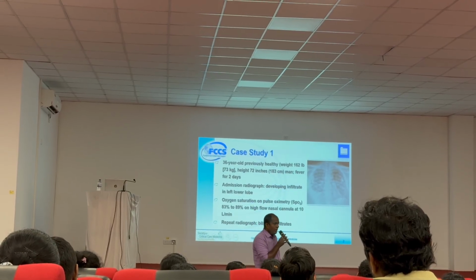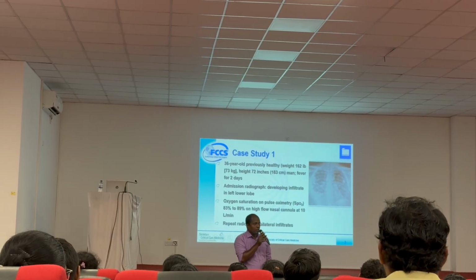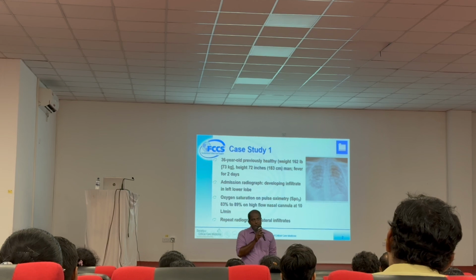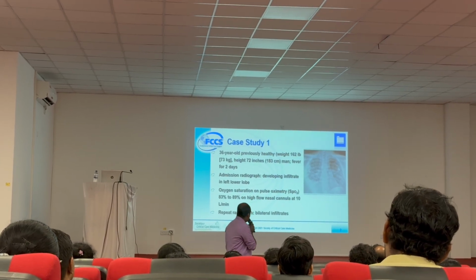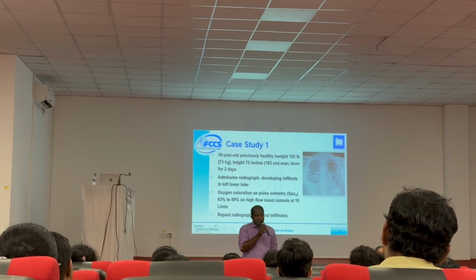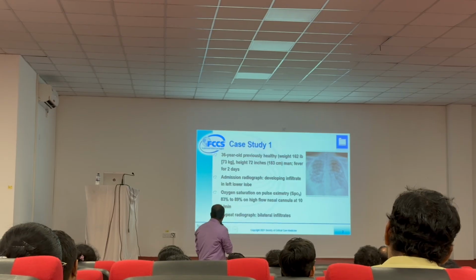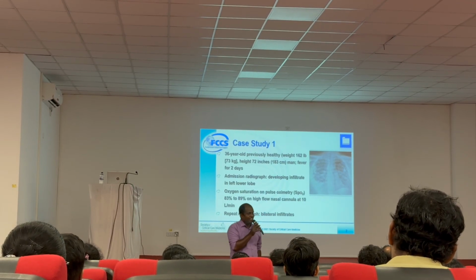You have the modules with you, I think. You have that on the slides and the module. Mechanical ventilation 2 is actually for difficult cases: how you ventilate and how the parameters change. When you are changing the parameters, what will happen? For that, you should understand some physiological background.